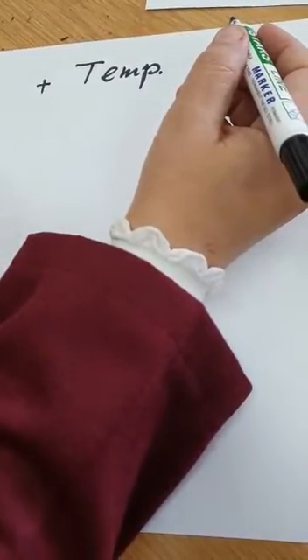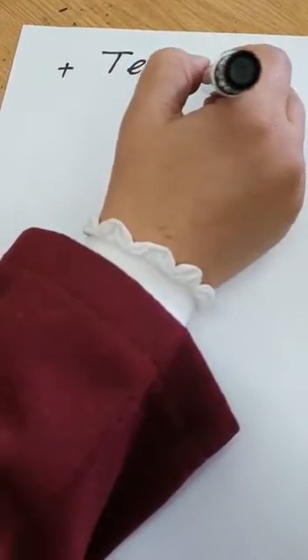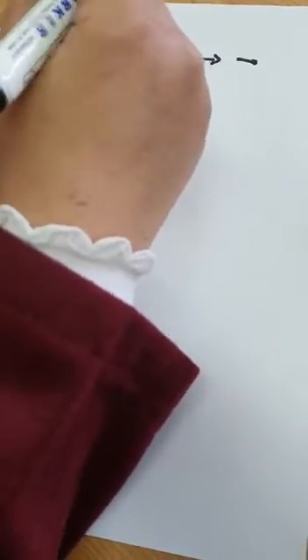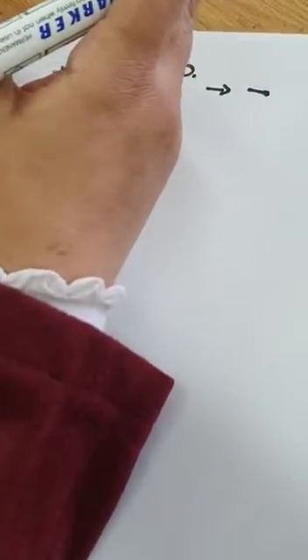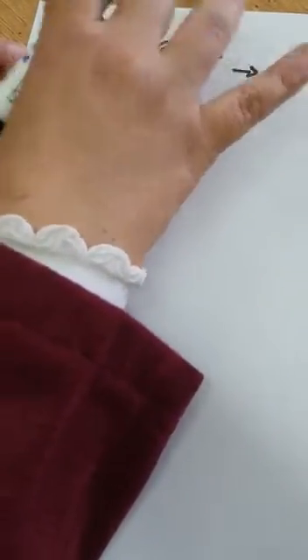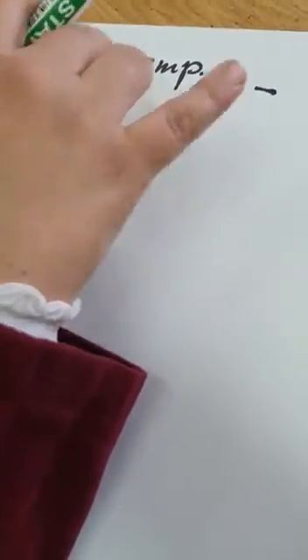Using the mockup material, which is usually an acrylic material, it's not very strong. So if you're going to use it for temporization, I would recommend less than 1, 2, or 3 days, maybe while waiting for the lab to send back the veneers if you have a local lab in your city, for example. And I've seen students leaving the mock-up there and allowing the patient 1 or 2 days. But once more, if you're going to use your mock-up material as a temporization method, it's short term, and you should have an emergency clinic for the patient to come back if anything fractured.